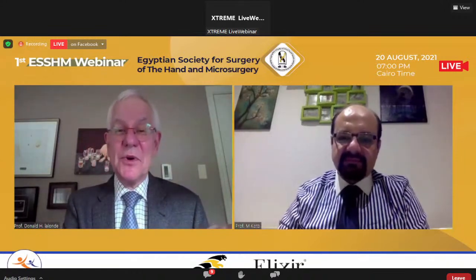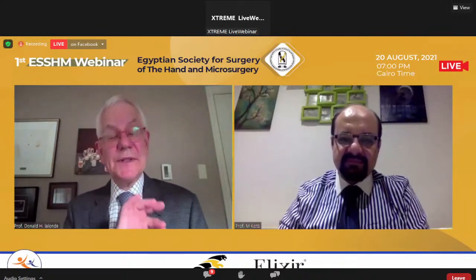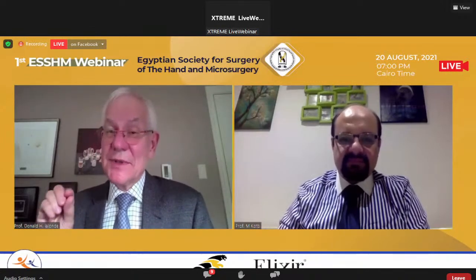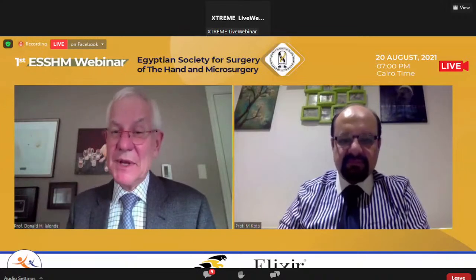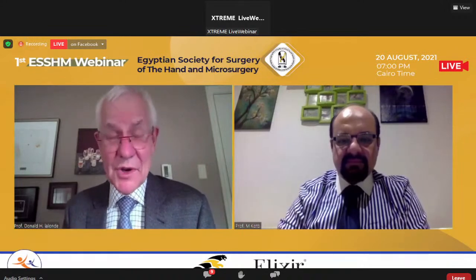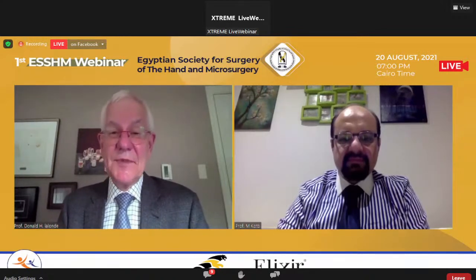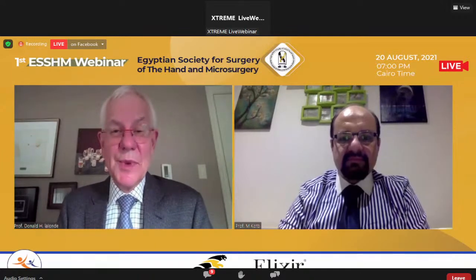I know I was showing old plates that were thick. And I know that the new plates are way better because they're smaller, but you're still doing all that dissection. And it's not about the plate. It's about how much scar people form over the plate, because everybody forms a different amount of scar. And some people form a lot of scar over even really small plates. So I still think the same thing holds. I think that the less dissection you do, the better.